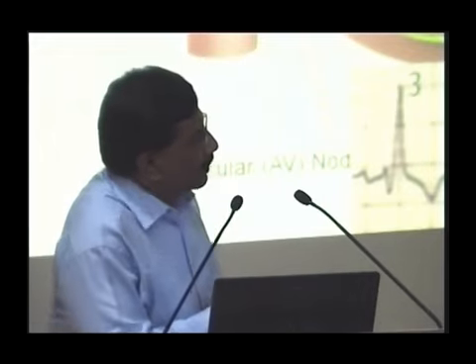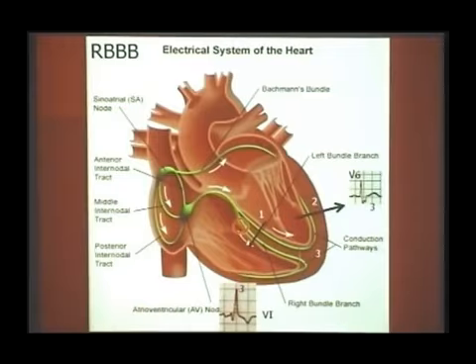So for the right ventricular depolarization, the impulse has to travel through the muscle from the left ventricle towards the right ventricle and then depolarize the right ventricle. So this is vector number 3. Normally we have only 2 vectors: the septal vector, then the simultaneous left and right ventricular activation vector, with dominant left vector, V5, V6 positive. That's what normally you have.